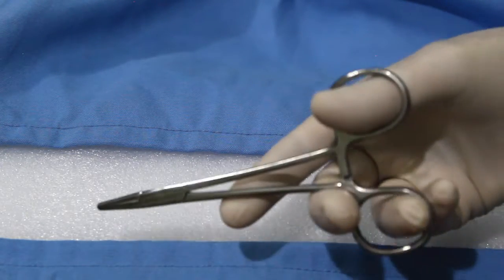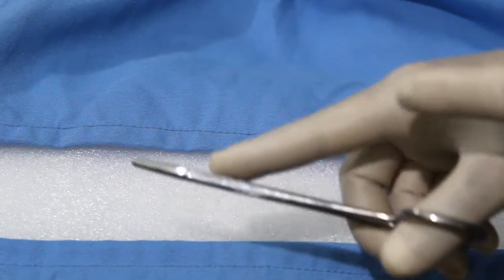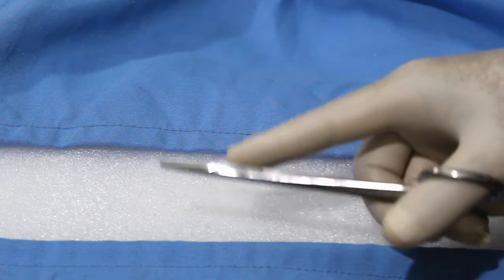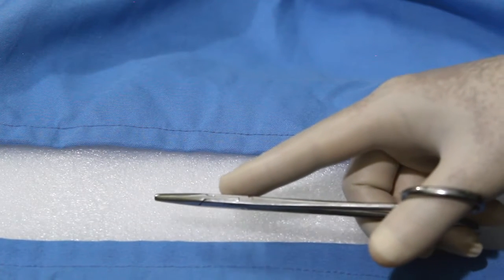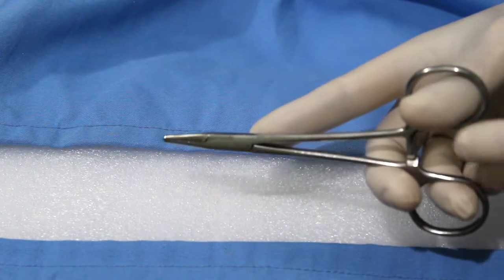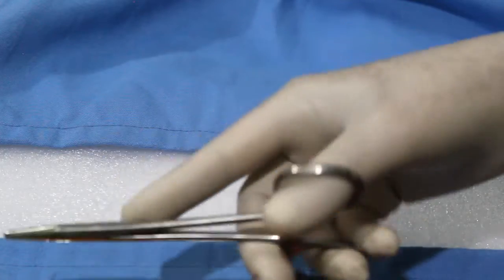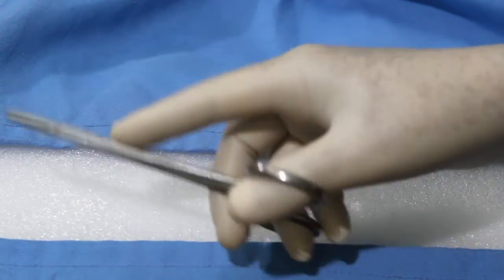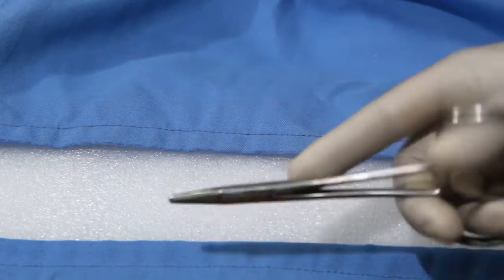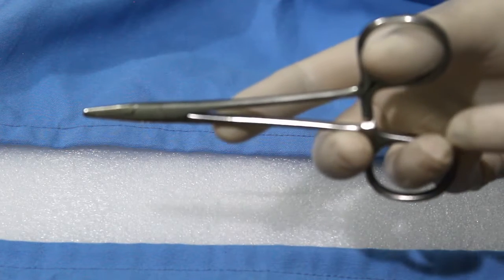For holding the needle holder, use it for opening and for closure. Use the tip of fingers, and the index finger is extended along the instrument to provide extra control and stability. Place only the fingertips through the handle loops, and the rotation should come from the wrist joint. For pick up and put down, these fingertips will help.